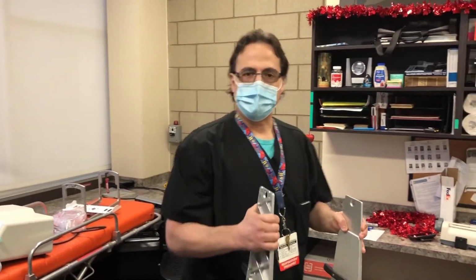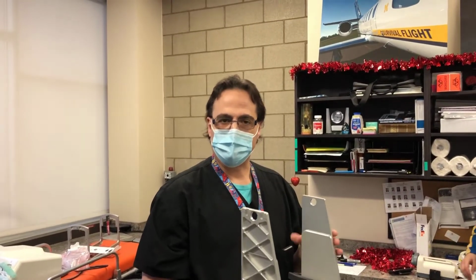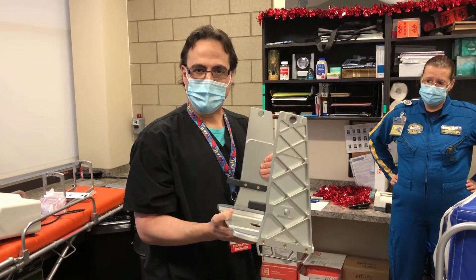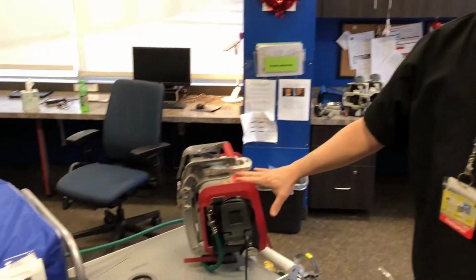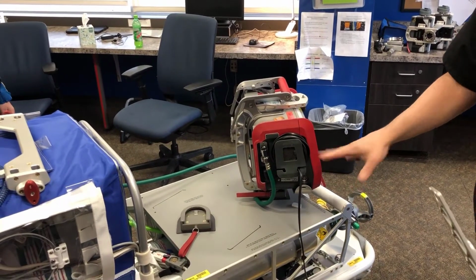So for the Mod RTs, one of your responsibilities will be not only to bring the jet ventilator and all the supplies for the jet ventilator, you will need to remove the bracket from the brand new ground Isolette and bring this bracket with you to be used on the fixed wing Isolette. So when we arrive, this is how survival flight will have the Hamilton configured, and it'll be mounted the way it's supposed to be mounted in the right position.